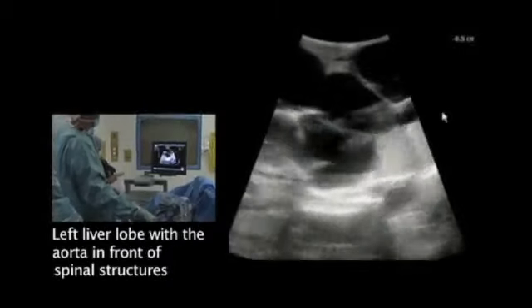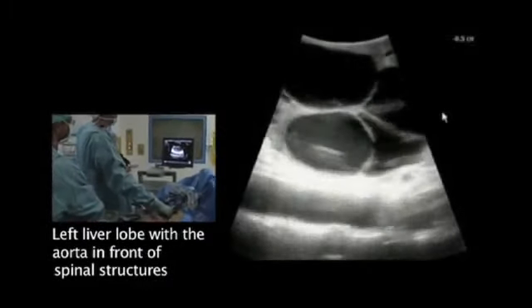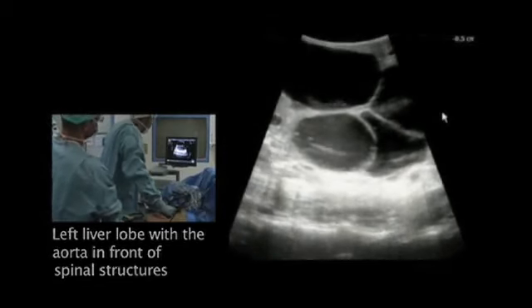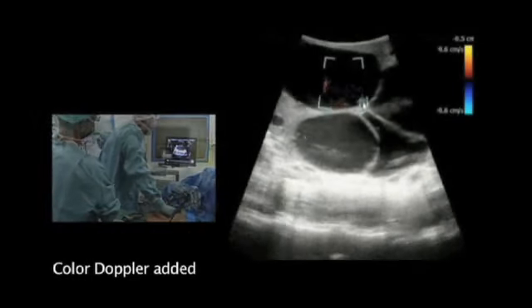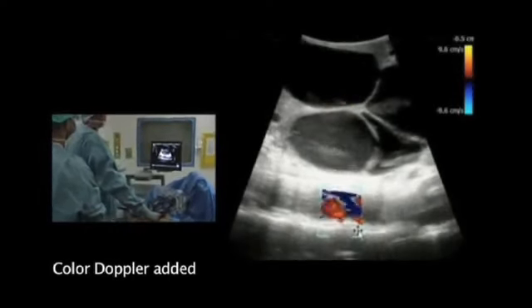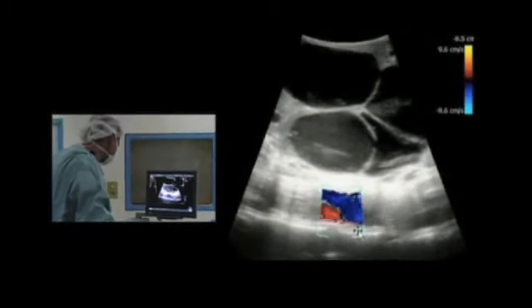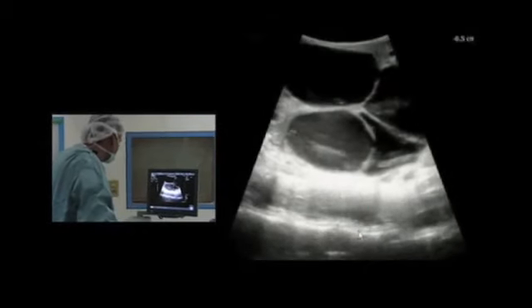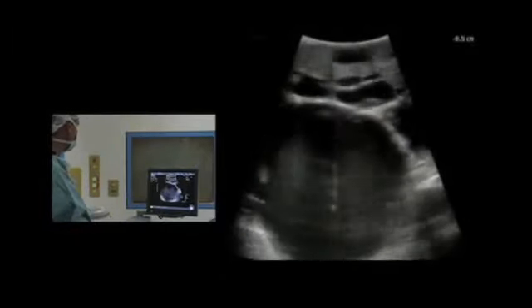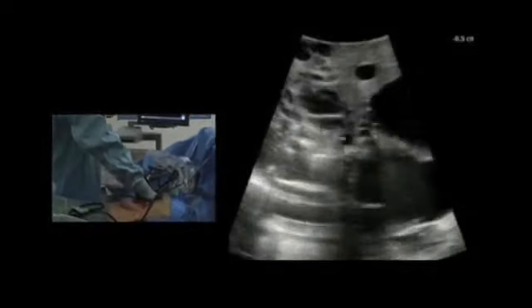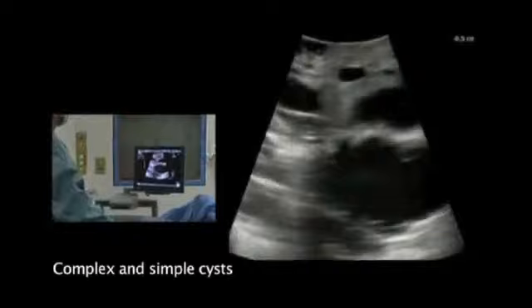On the left lobe here, keeping it so we have the aorta in the lower part of the image. I can here try to add the color, and we can identify the aorta here in front of the spinal structure. Then we will move away from here — that is in the left liver lobe. We go to the right liver lobe and all the way upwards as far as the dissection allows. We can see the cystic structures out here become more complex, whereas it is a little more simple cystic appearance here.